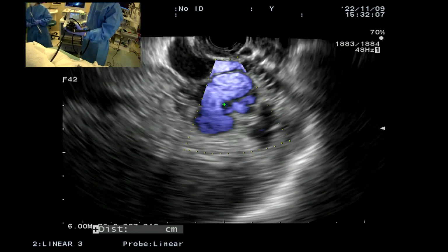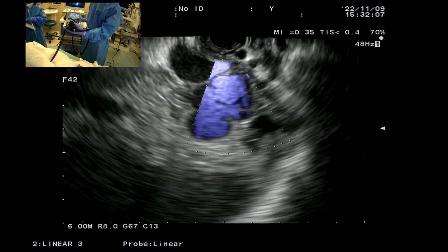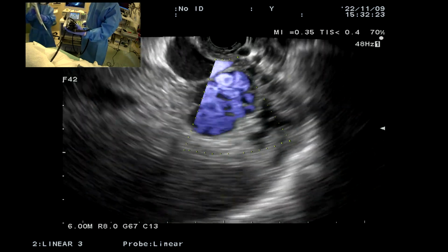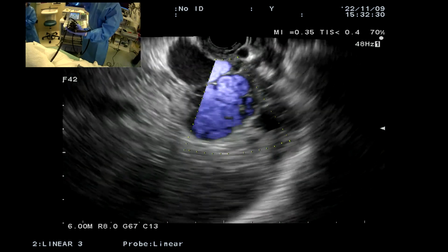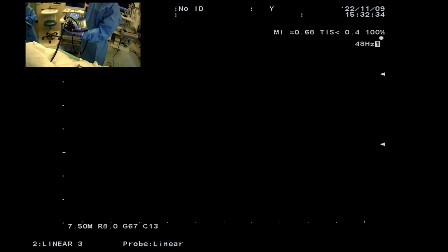We can measure the diameter of this big varix here, and it's 2.8. Our largest coil is 2, but we're going to put 2 of them in. They're also 15 centimeters long? So 15? 14, yeah. So it's going to make a number of coils. I can't remember exactly how many. I think it's like 4 loops, I should say. 4 loops. And we'll take the Doppler off.